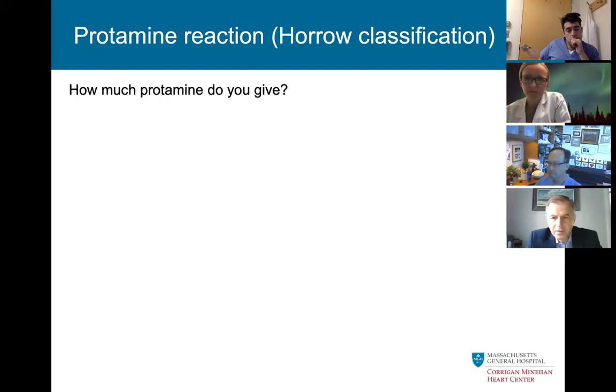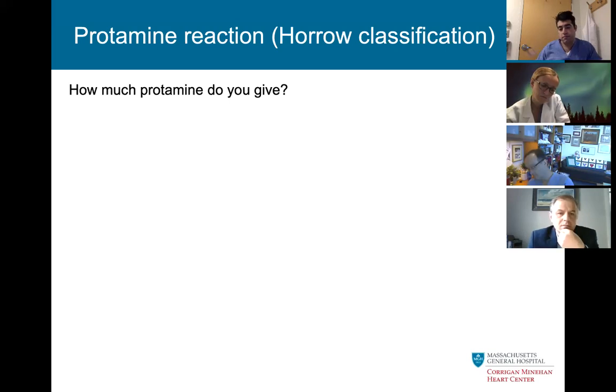Great, thank you. I'm sorry again, I know we're not supposed to drag this on, but the LV vent is a very good de-airing vent. I don't use it. I only use the LV vent in circ arrest cases, but I think that the LV vent is a phenomenal de-airing vent. So I disagree with the statement that it's not a de-airing vent. Just for the residents, to be careful. What I thought would be consensus, but you get the idea.